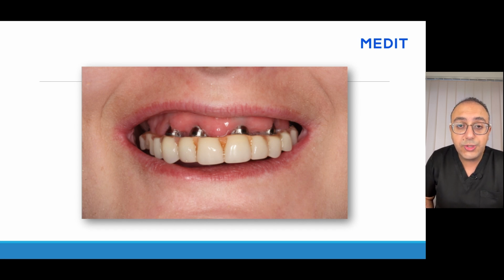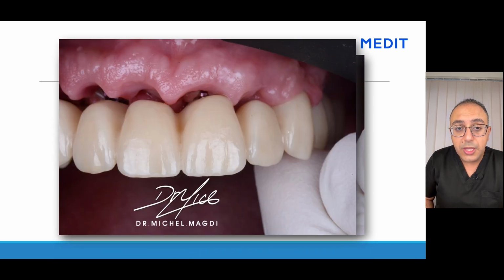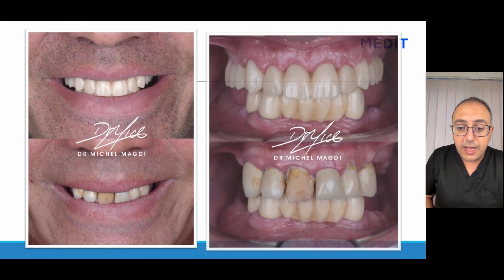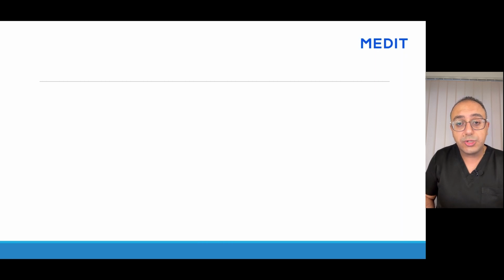And if you want to avoid this, and this is how I do my job, you can feel the difference now. You can see the arch, the teeth with the shaped gingival papillae. You can see the anatomical imitation of the original dentition. So let me take you now on a tour to see how we can do this work. This is also the same case, the final results before treating the lower arch.